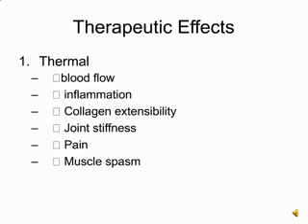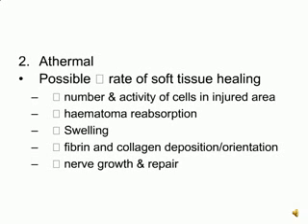Therapeutic effects include those thermal effects described for superficial heat and ultrasound. The non-thermal effects described mainly relate to the healing process and include an increase in the number and activity of cells involved with the healing process, reabsorption of hematomas, reductions in swelling, particularly indurated swelling, an increase in fibrin and collagen repair, and increased neural repair.